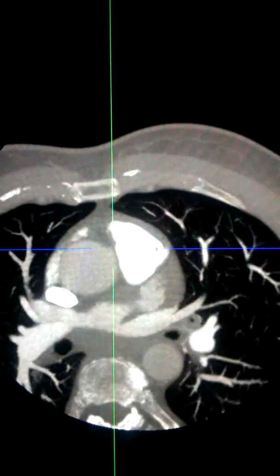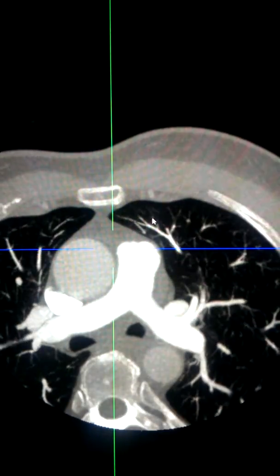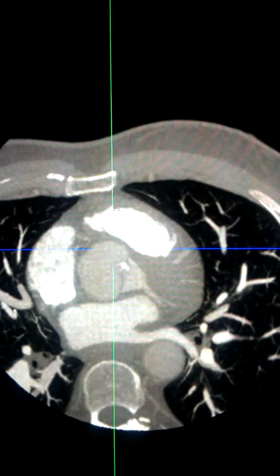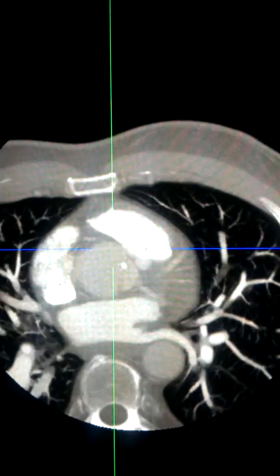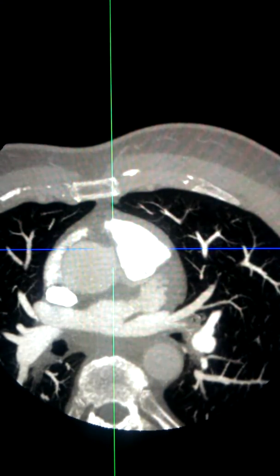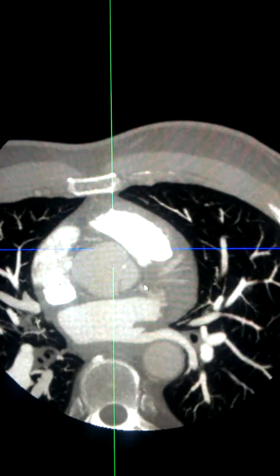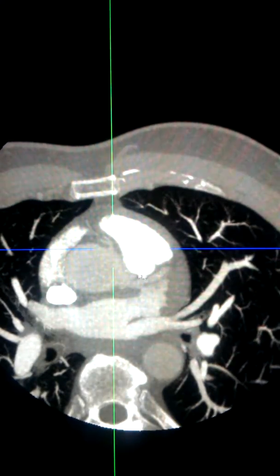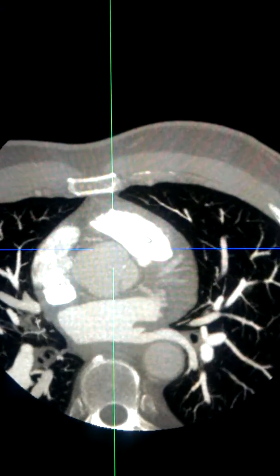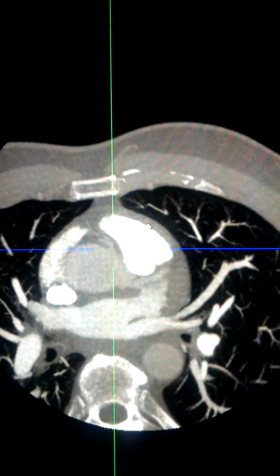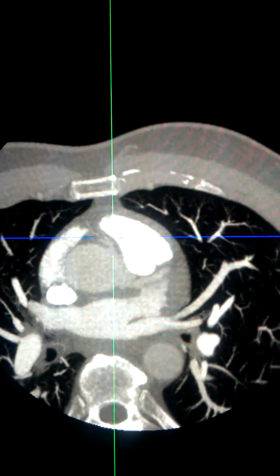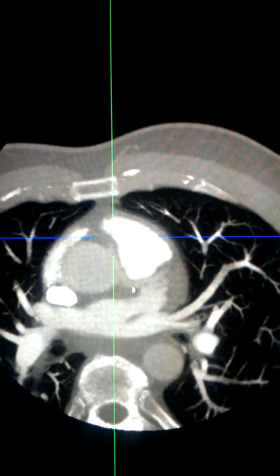Here we have the pulmonary artery arising from the right ventricle, and here we have the systemic aorta. This form of coronary arterial variant is classified as a malignant variant due to it being wedged between two high-pressure chambers.